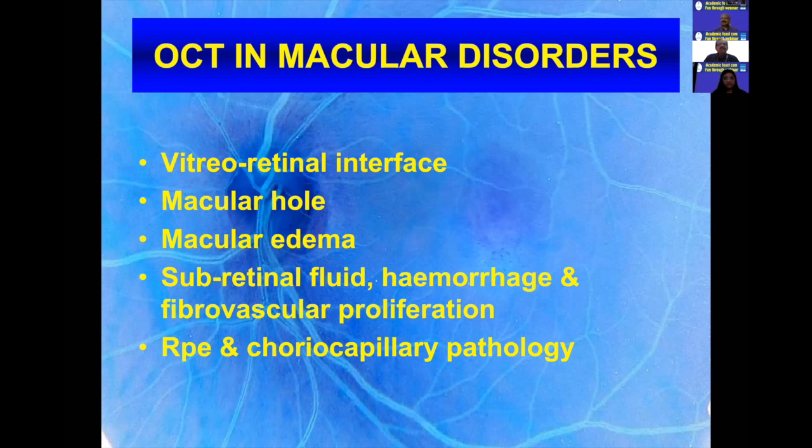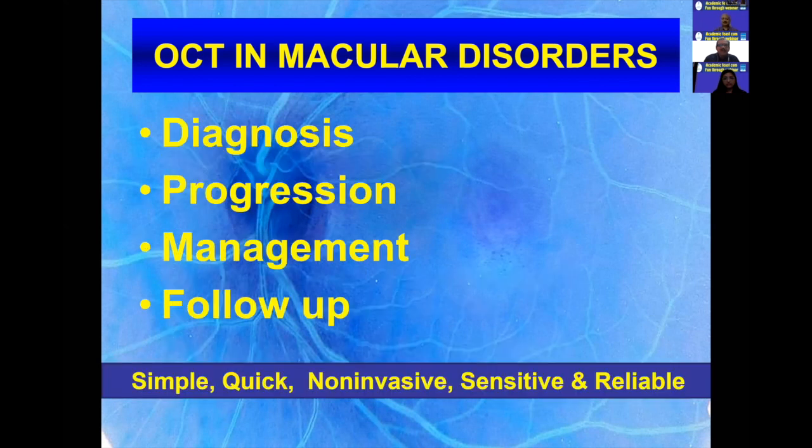OCT is helpful in diagnosing these conditions, assessing the progression of these situations, deciding the management of various macular disorders, and also very effectively following up these patients after the treatment. OCT is a simple, quick, non-invasive, sensitive, and a very reliable tool for assessing these macular disorders.